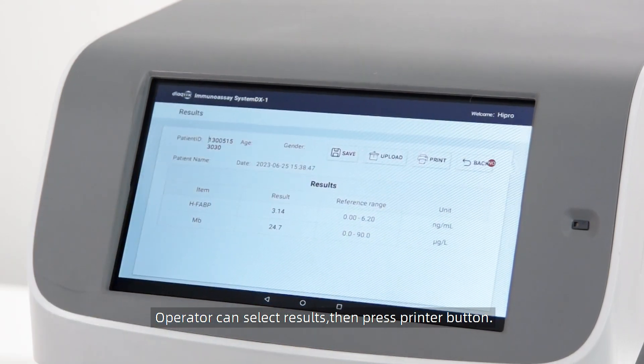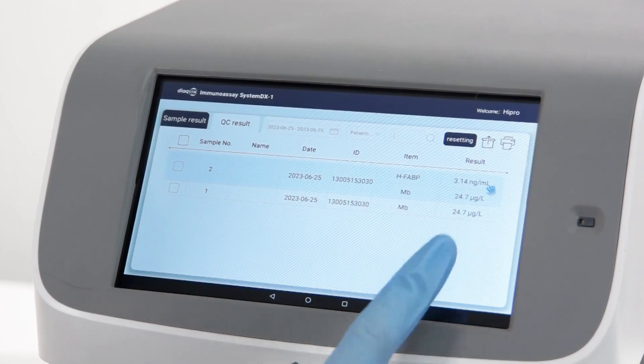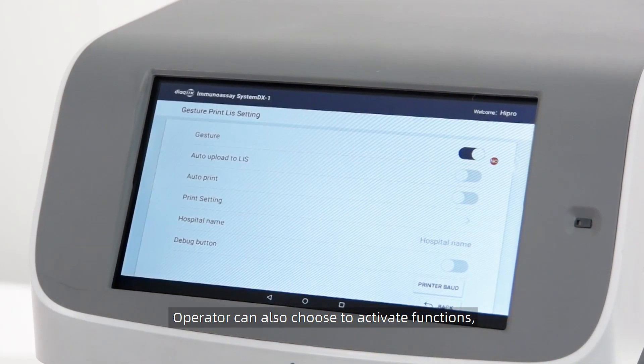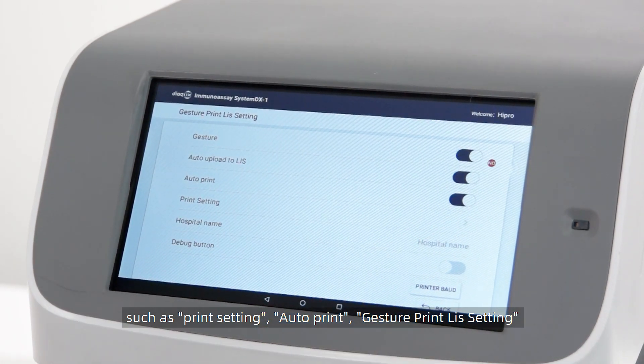The operator can select results and press the printer button to print. The operator can also activate functions such as print setting, auto print, and test print list setting.